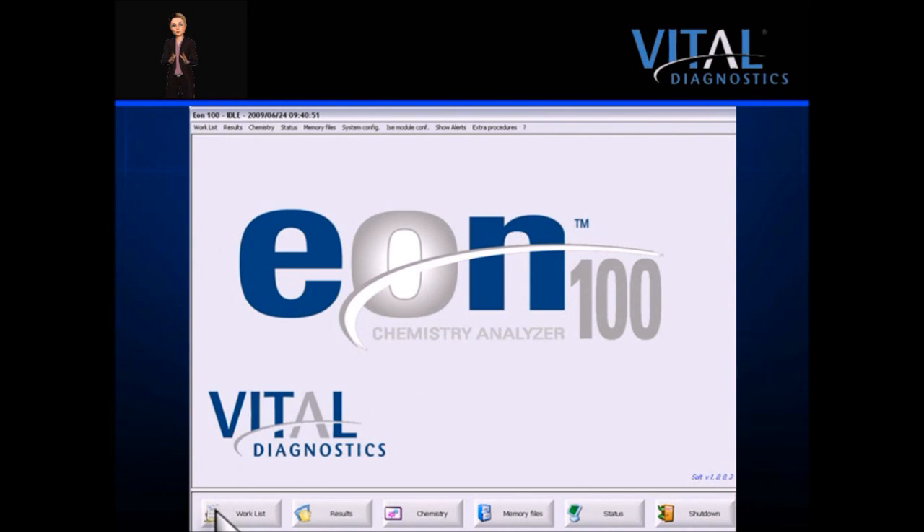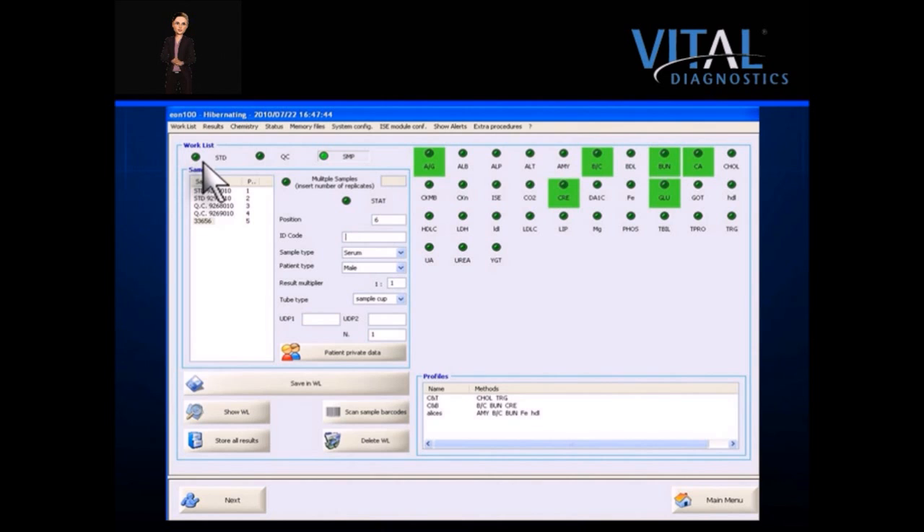The work list is also the order entry screen, where standards, controls, and patients are programmed. The system automatically assigns their position for the sample. ID code, sample, patient, and tube type are manually entered. If the lab has an LIS and the samples are barcoded, clicking on Scan Sample Barcodes will upload patient and test data. Patient demographic information can be entered by clicking on the patient private data icon. The list of programmed assays is displayed on the right; green indicates active reagents on board ready for testing. Custom designed profiles or panels can be created or modified with a few clicks. Once tests have been ordered, click Next to review the work list, and the system is ready to run.